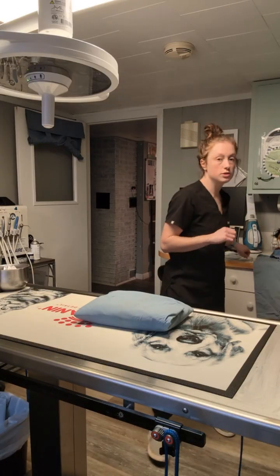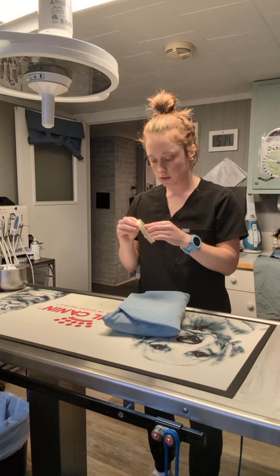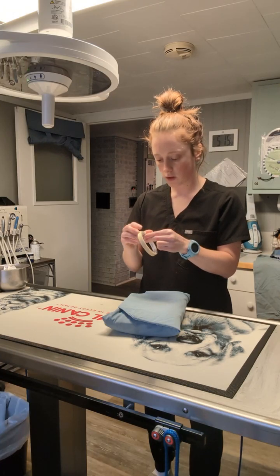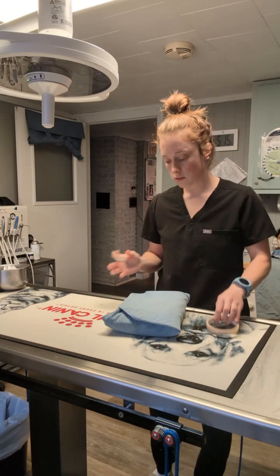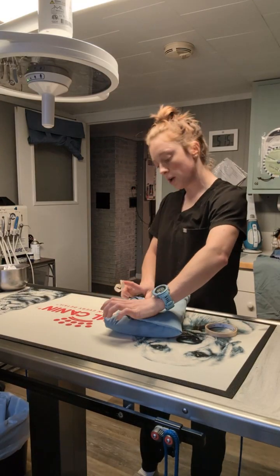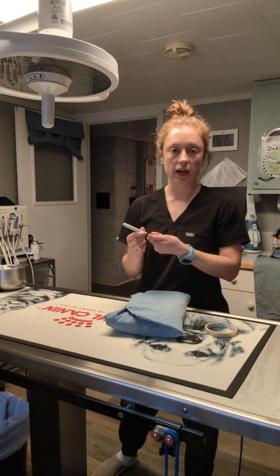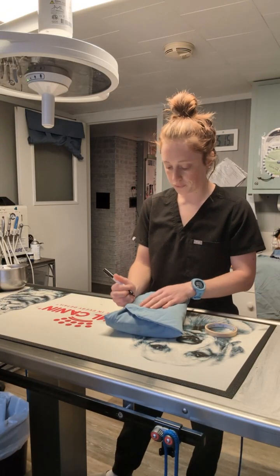And I want to secure it with my steam tape. Make sure there's enough of a corner sticking out to grab. There we go, that's better. And I want to put my initials, the gown, and the date on the tape.